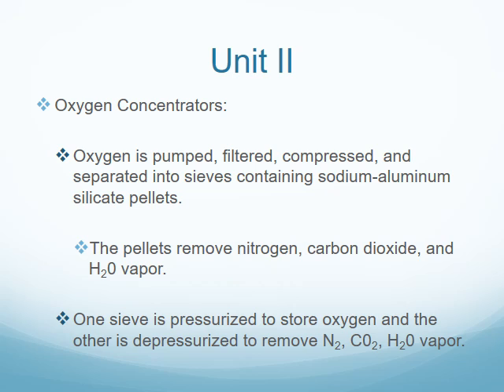The oxygen is pumped, filtered, compressed, and separated into sieves containing sodium and aluminum silicate pellets. The pellets remove the nitrogen, carbon dioxide, and water vapor. So one sieve is pressurized to store oxygen and the other is depressurized to remove the nitrogen, carbon dioxide, and the water vapor.